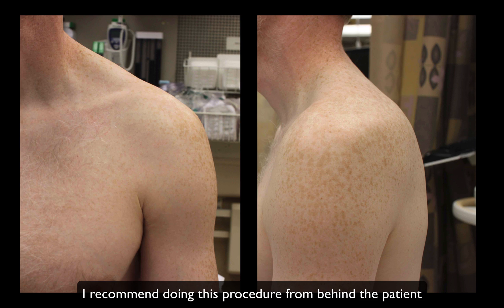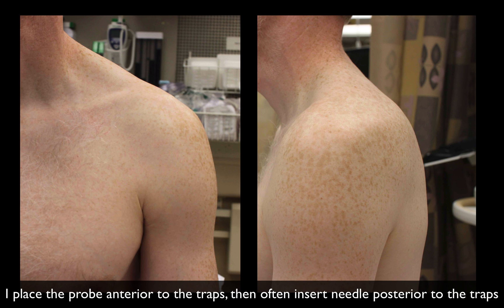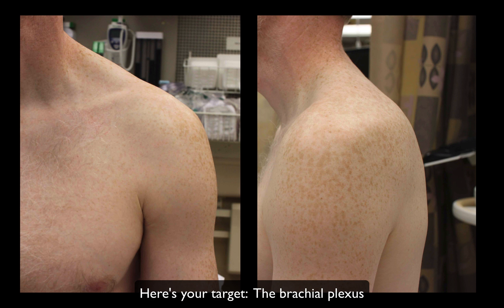Here's the surface anatomy. When performing this procedure, I would highly recommend going from behind the patient — sitting at the head of the bed. I usually put some towels behind the patient so this whole area is exposed and the bed doesn't get in the way. When you do it this way, you have so much more ergonomicity. Sometimes the patient has a well-developed trapezius muscle — I find myself going through the trap muscle with the needle, even though the probe is anterior. The probe will be here and the needle will come in from behind, in-plane with the ultrasound beam.